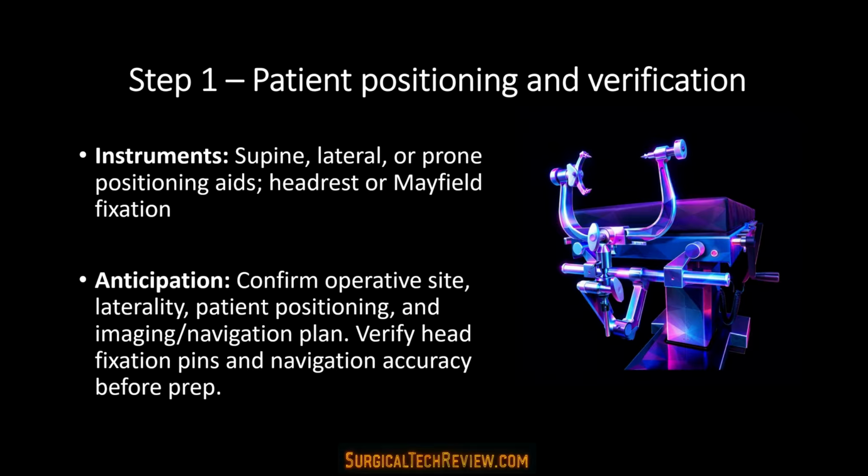Step 1. Positioning and verification. The patient is positioned based on the location of the pathology and the head is secured. A timeout is performed to confirm the correct patient, procedure, site, and imaging.